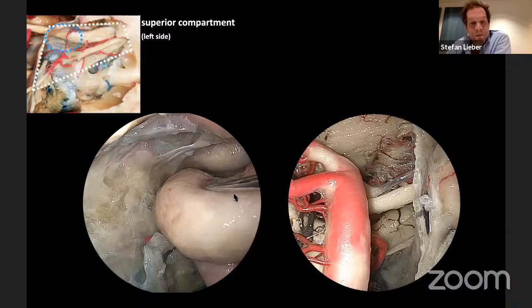The horizontal aspect is depressed just to expose the 3rd nerve in the roof of the cavernous sinus. And this is the view, obviously not in the cavernous sinus, but into the posterior cisternal space to see the entry of 3 traveling here between SCA and PCA, and 4, which enters the foramen over the roof of the cavernous sinus also.